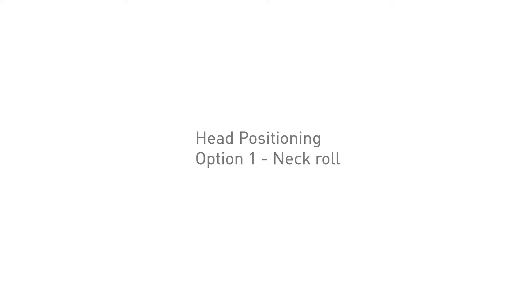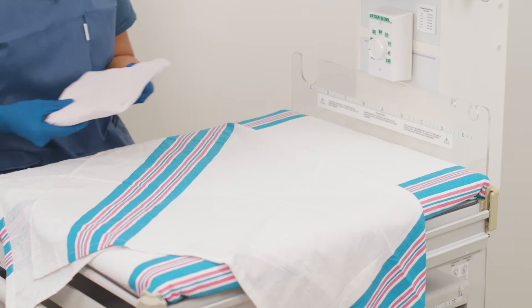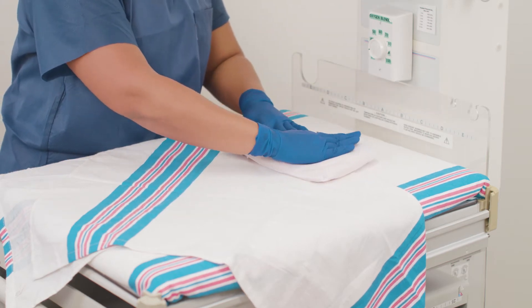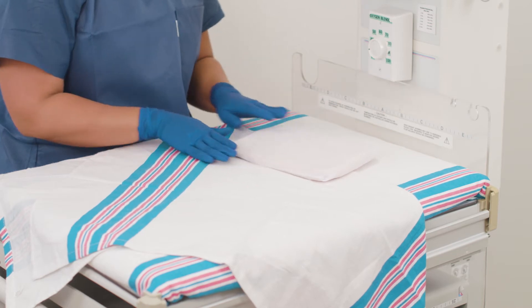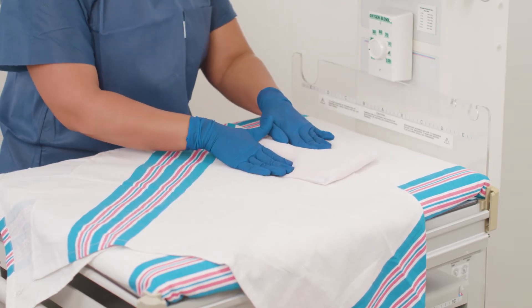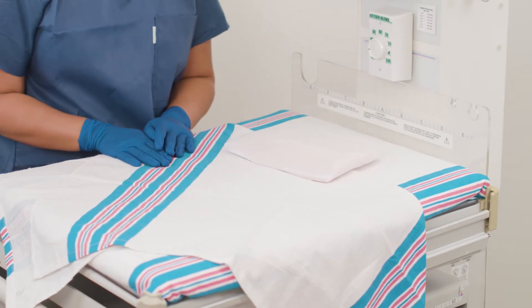Option one: creating a neck roll on the positioner. Begin with the positioner flat and inside the cover. Using the flat side of both hands and starting from the long edges of the positioner, flatten inwards towards the center of the positioner along the short edge to create a neck roll. Using fingers, adjust the height of the neck roll and width as per the baby's neck size.